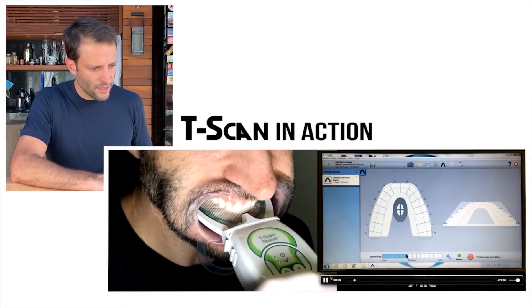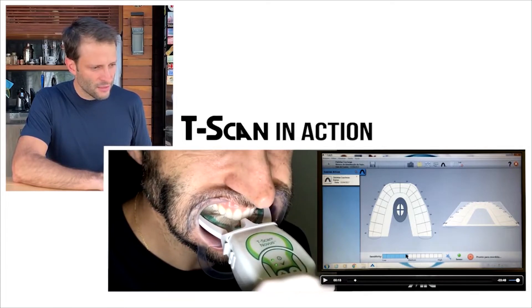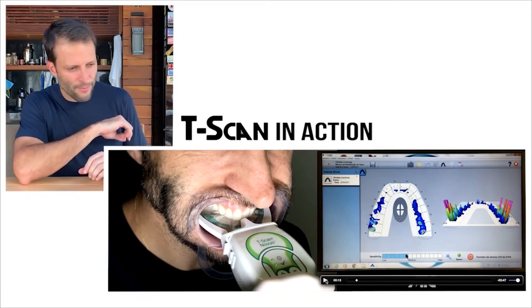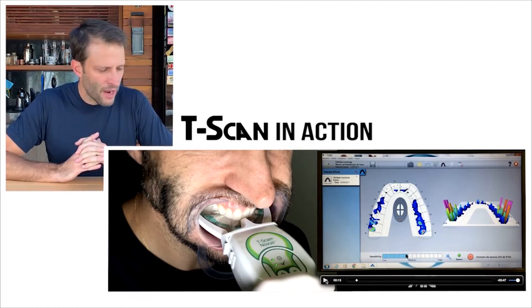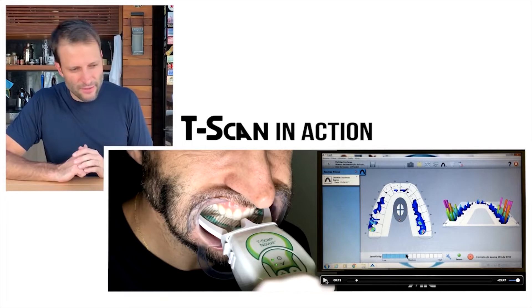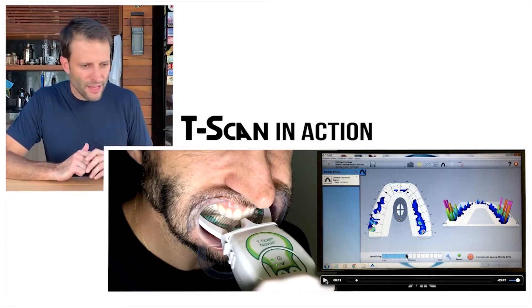As I'm biting together on the left side, you're going to see on the right side how the timeline happens, and you can see exactly where we have more occlusal load. In my maximum intercuspation, you can see the load is on the molars. Right at the beginning, there's more load on my left side molar area, not much on my bicuspid left side.